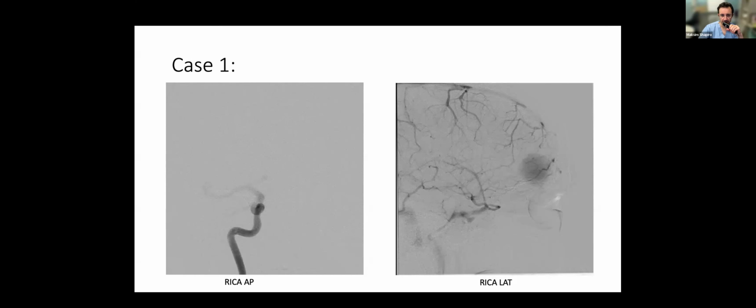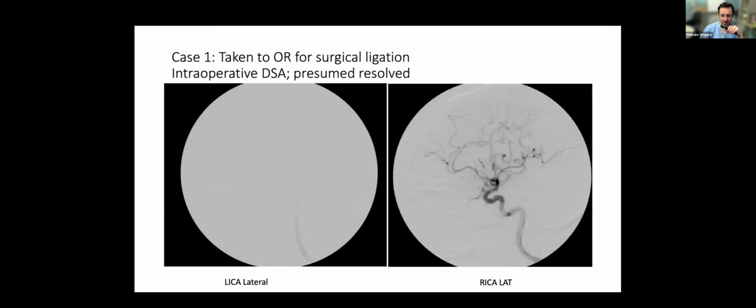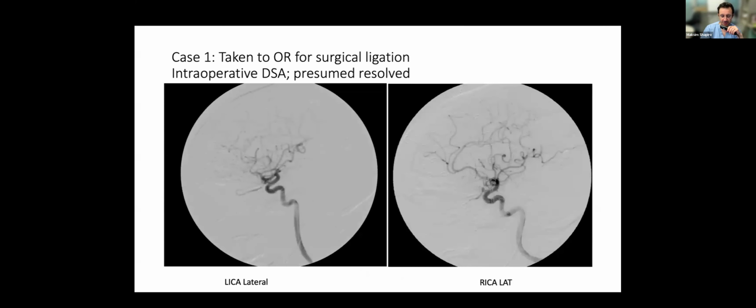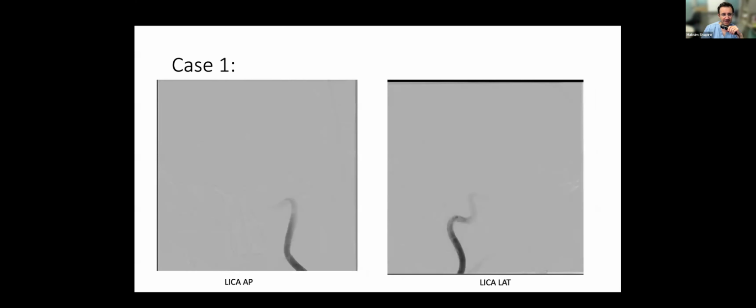I think Eytan's comment is important in the sense that sometimes there is a route from the external carotid, which you investigated, that allows those who are not comfortable with catheterizing the ophthalmic to treat it, which can be discussed, and you could still reflux into the ophthalmic from the external injection. Now let's keep going. You mentioned a number of times something about the cribriform. I guess you meant that there are anterior and posterior ethmoid arteries supplying this, or you meant ethmoid air cells. I'm not so sure about that.